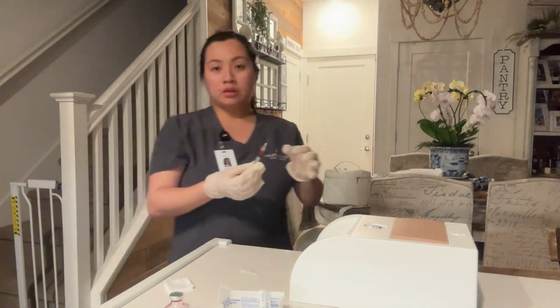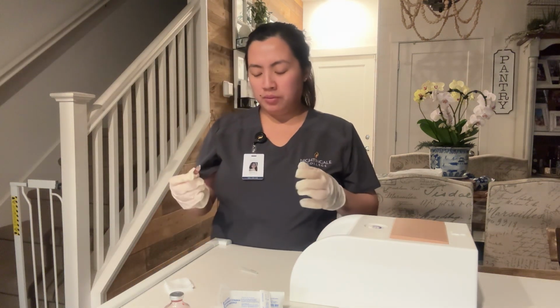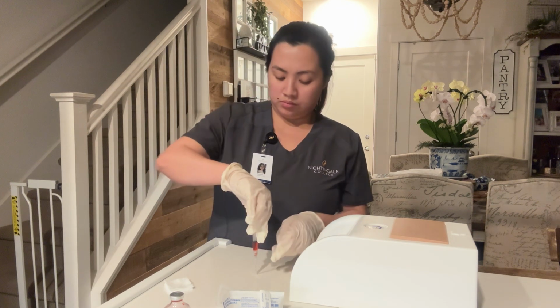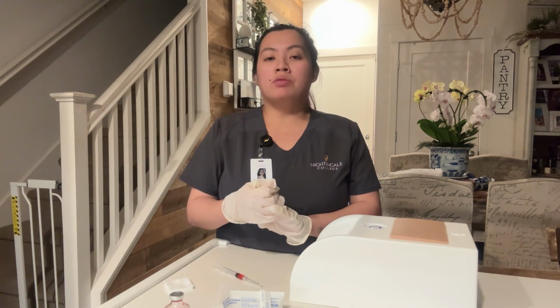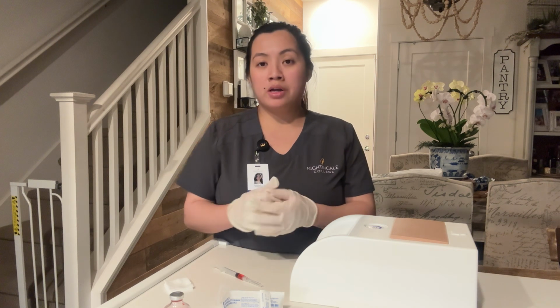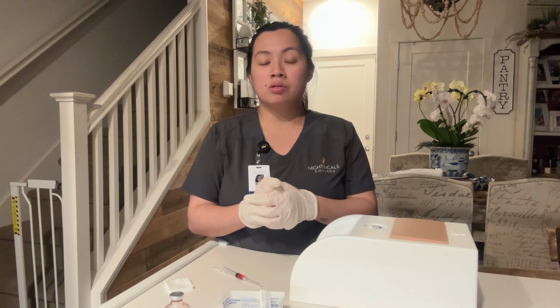We're going to select an appropriate site. Sorry, I'm going to recap the needle first. Okay, so we're going to select an appropriate site, avoiding bruises, inflammation, or tenderness. And then when we inject the heparin, the recommended sites are thigh or abdominal area, and we're gonna administer the heparin at least 2 inches to the right or left of the umbilicus.